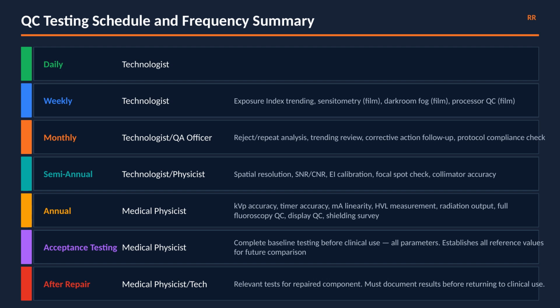mA linearity, HVL measurement, full radiation output, complete fluoroscopy QC, display monitor physics testing, and shielding survey. Acceptance testing, medical physicist only, complete baseline testing of all parameters before the unit enters clinical use. Establishes every reference value used for comparison in all future QC testing.